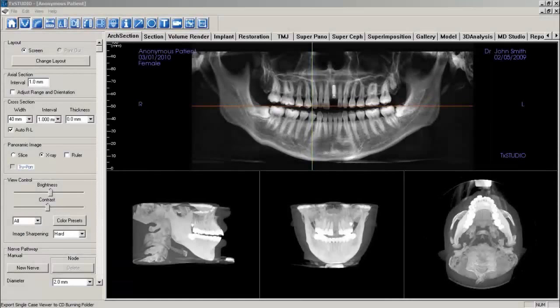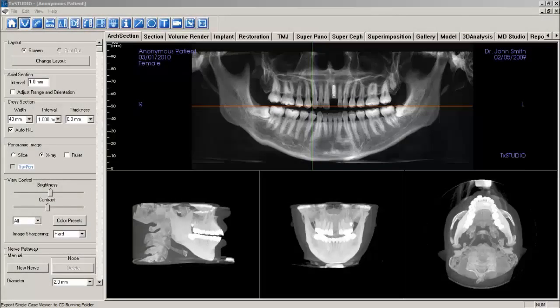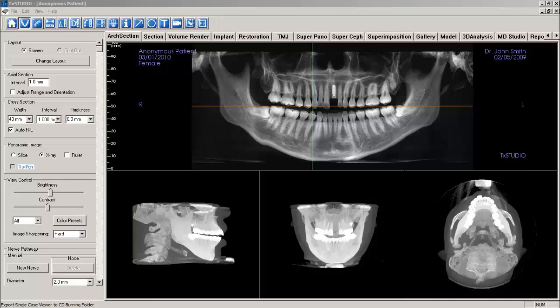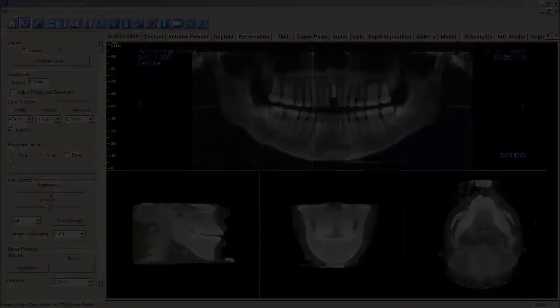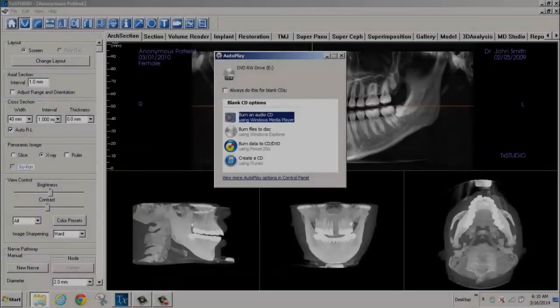Welcome to a tutorial for exporting DICOM in Treatment Studio Viewer to CD. After a patient scan has been opened by Treatment Studio, insert a blank CDR into your computer's DVD CD burner.